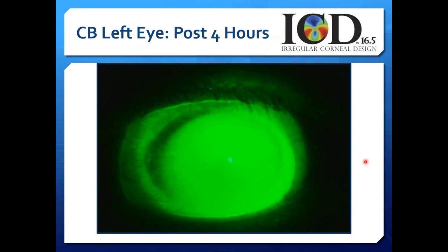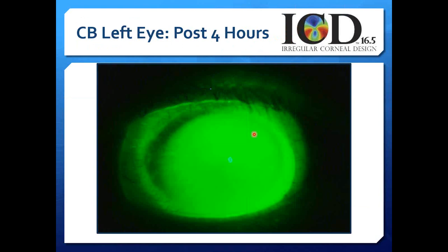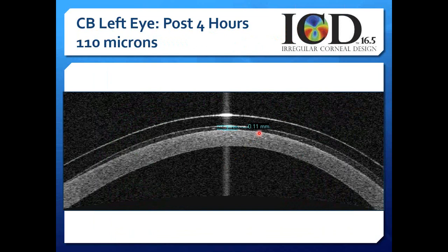Here's the same patient after 4 hours of settling. Notice again the central clearance of the lens. Looks like there's plenty of fluid between lens and cornea. When you pull up the OCT, that lens is actually sunk to only 110 microns of apical clearance. Isn't it interesting how much fluid this slit lamp image would appear to have, yet we're down to only 110 microns. So the slit lamp image in the open beam can be kind of misleading, and that's why the optic section or your OCT is really helpful.